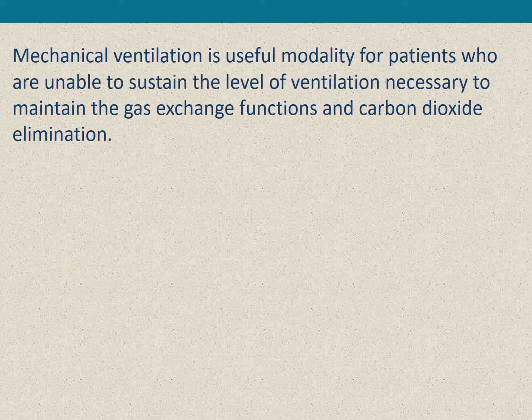Basically, mechanical ventilation is a useful modality for patients who are unable to sustain the level of ventilation necessary to maintain gas exchange function and carbon dioxide elimination.